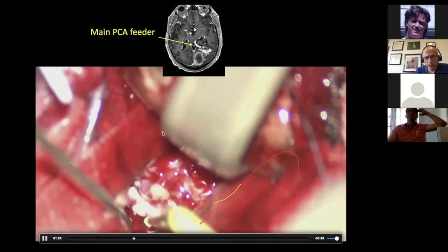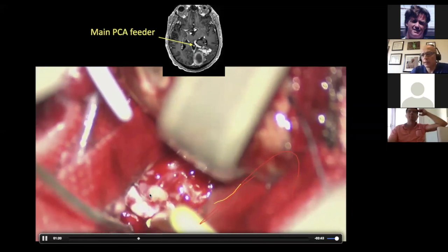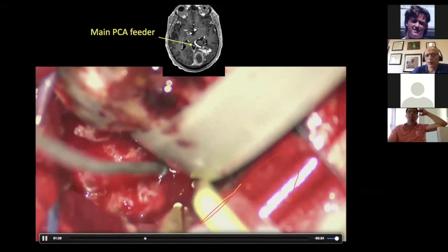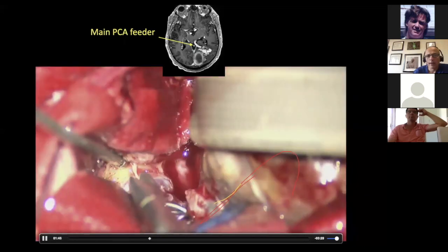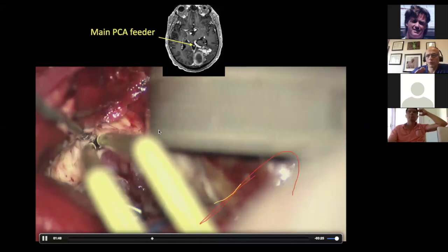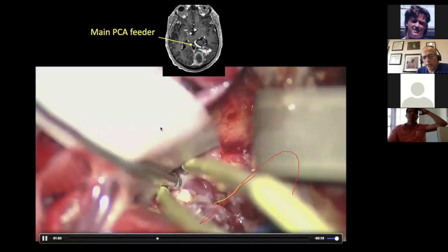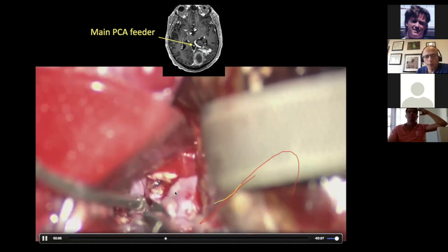Don't be minimalistic. See, it's bleeding, and a part of the AVM is calcified, and it makes it difficult to manipulate. So if it is bleeding, just tamponade, okay? Tamponade on the AVM side, not on the brain side. And actually, see these, we had multiple bleeds, and every time I put the surgical or gel foam and cotton and then the retractor on top of it. So I'm going to find that. See, it is going to become very obvious soon. There are these feeders coming from that large PCA.